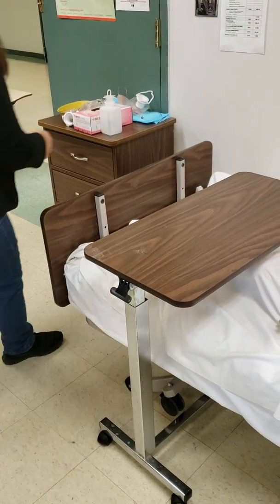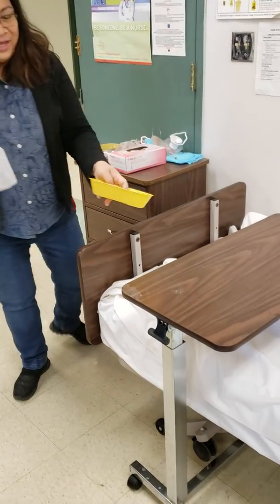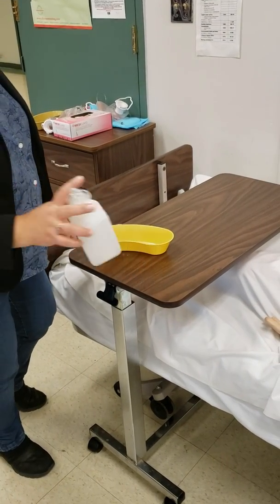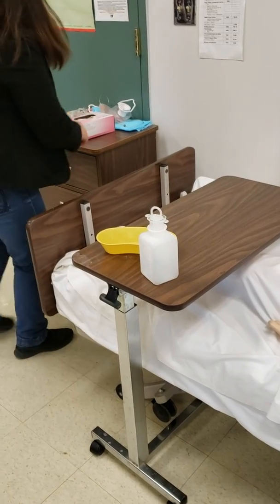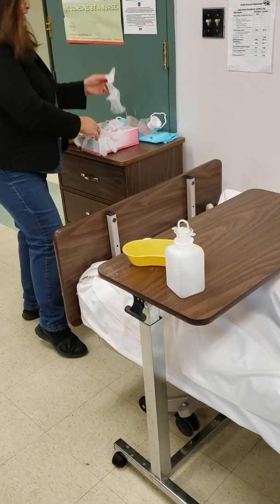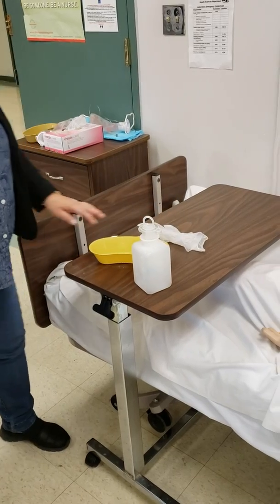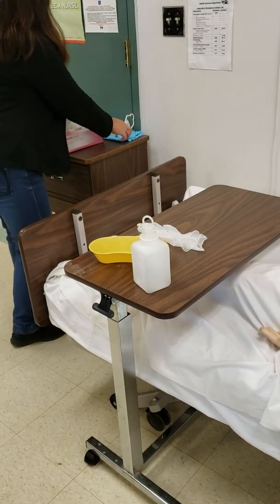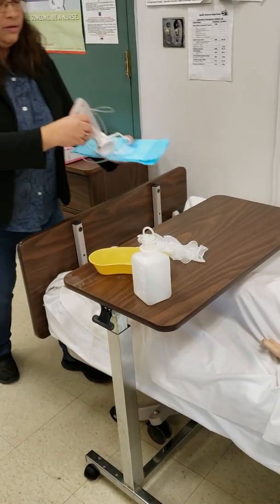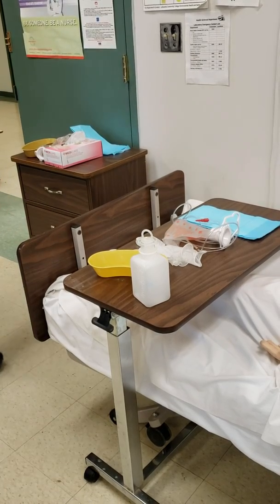So you will gather your supplies. You need your emesis basin, which is this. You need, what do you call this? I forgot the name. Whatever. And a 60 cc syringe, and a pair of clean gloves, the chalk, and your bag, the kangaroo bag. Let me grab the solution. Okay.